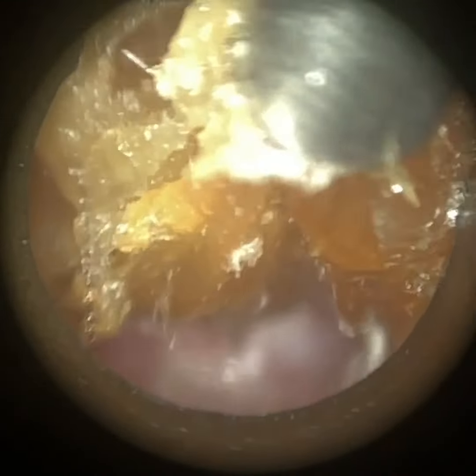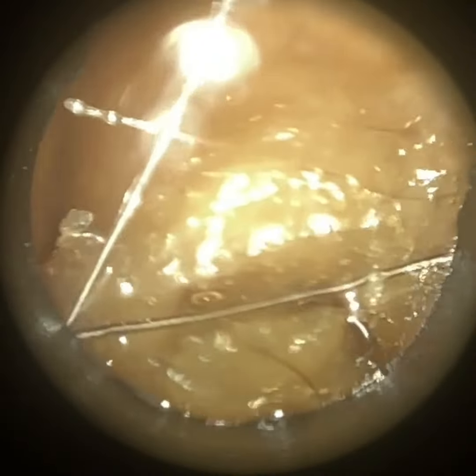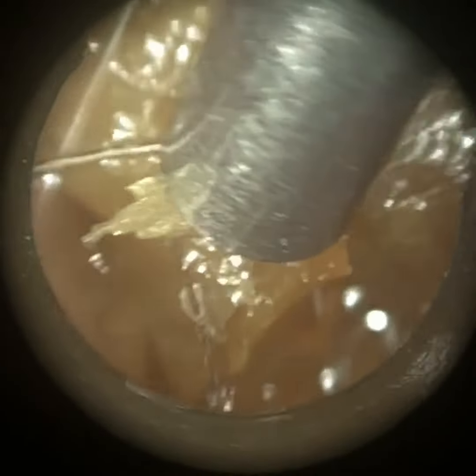I'm just trying to wriggle this — you can see it separating from the floor, from the bed of the ear canal. I'm almost kind of stretching the skin away. So I'll put some oil in. I use a bit of olive oil spray. Just dilating the ear canal entrance, as the entrance is a bit narrow.